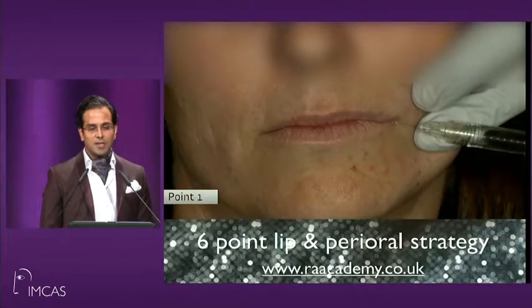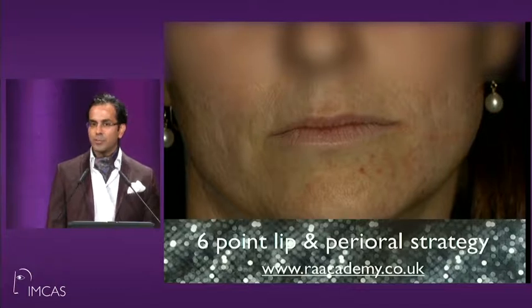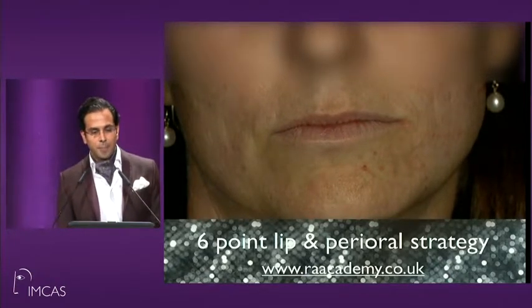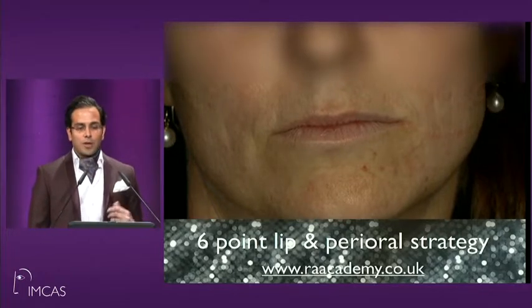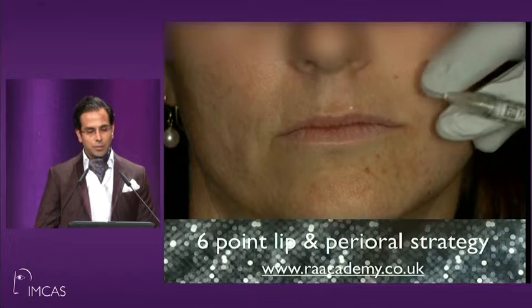So tiniest intradermal injection, and all of a sudden, look how that corner of the mouth just pops up, like it's got a piece of string attached to it. And now the next job is to evert the lip. We want to give a little bit more mucosal show.